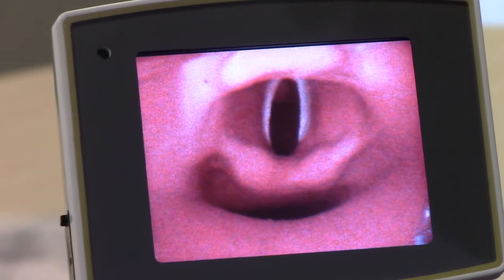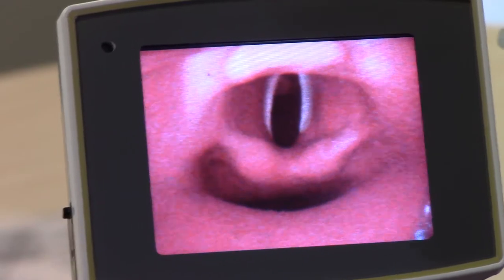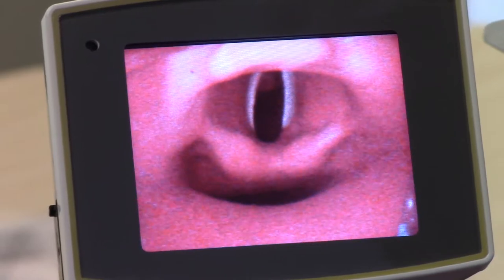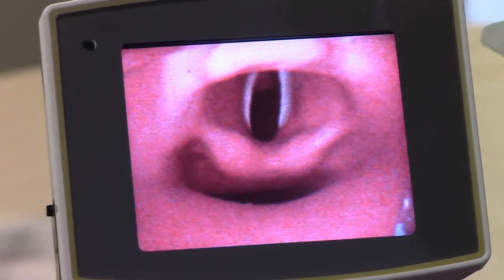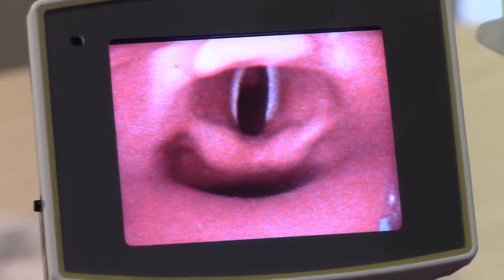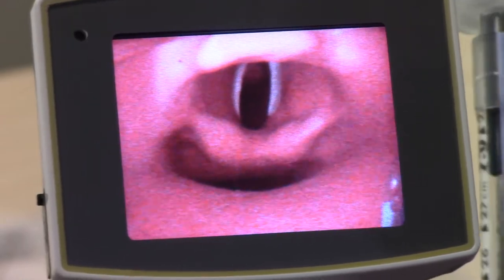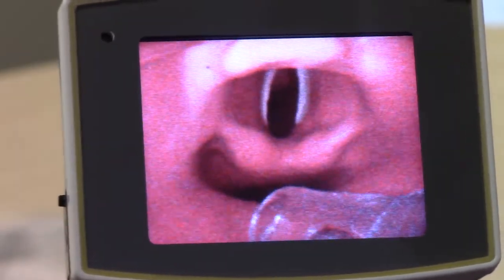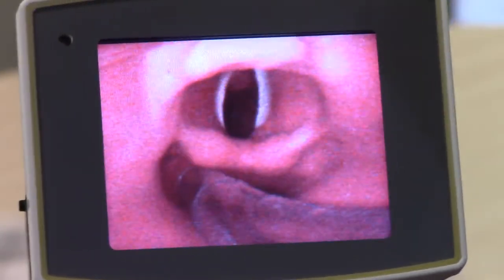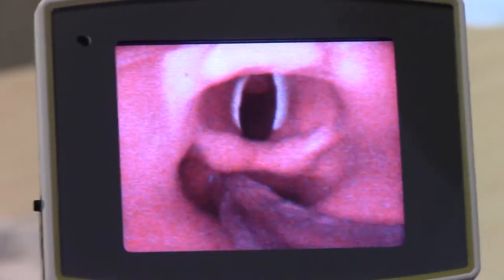Current video laryngoscopy technology allows practitioners outstanding views of the glottic opening through its indirect camera design. Limitations with current semi-rigid stylettes do not allow practitioners to easily maneuver the tip of the endotracheal tube anteriorly and into the glottic opening, oftentimes creating an environment where the endotracheal tube becomes hung up below the level of the vocal cords in the piriform recess, as seen here.